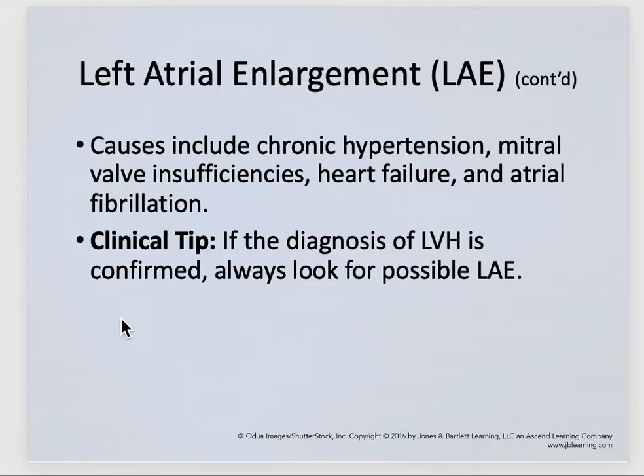So with left atrial enlargement, again, chronic hypertension, pressure overload. When someone has left atrial enlargement, if the diagnosis is LVH. So just to preface this talk, we are right now talking about the atrium. Most common, probably 90% of your time in a clinical setting, you're going to be looking at hypertrophy problems, ventricular hypertrophy. So if the diagnosis is left ventricular hypertrophy, which is very common, if it's confirmed, you also want to go backwards, look up the heart and say, well, if this fella has left ventricular hypertrophy, there's a high probability we're probably also going to see left atrial enlargement up in the atrium.